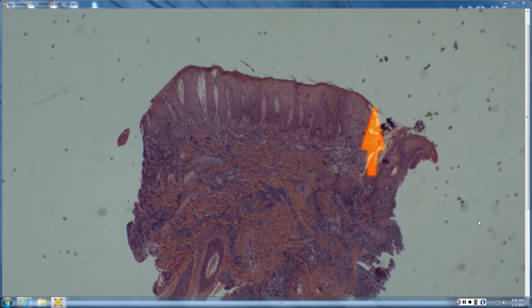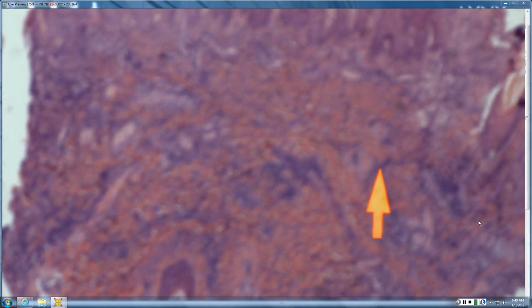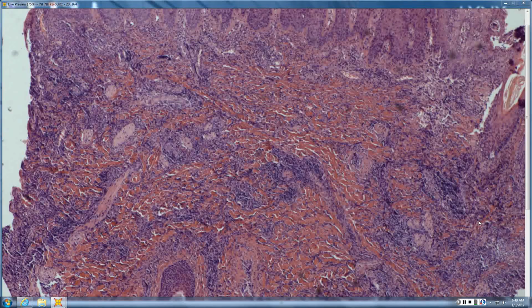It's actually within the hair follicles, and if not within the hair shafts, so you have to look closely to see that. Certainly there's a lot of inflammation going on. The skin is not happy. There's a lot of spongiosis. The deep-seated Majocchi's type of tinea really produces a robust inflammatory response.